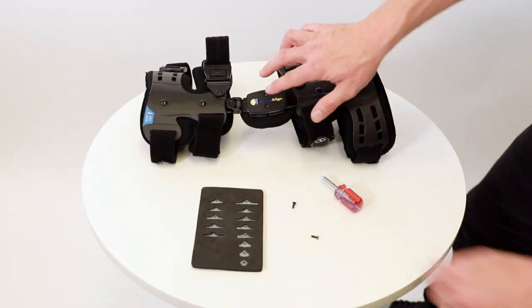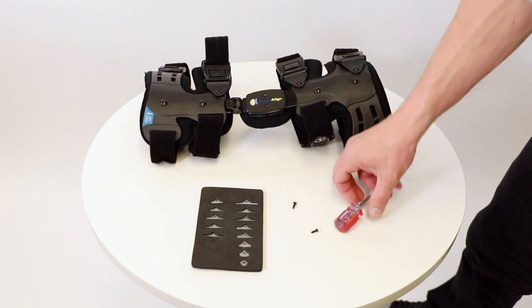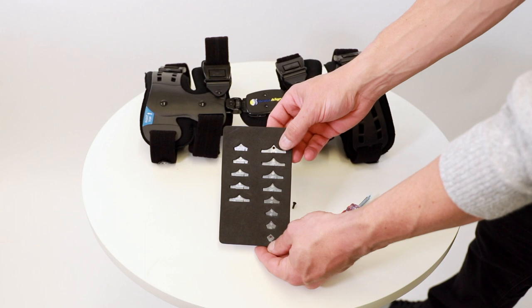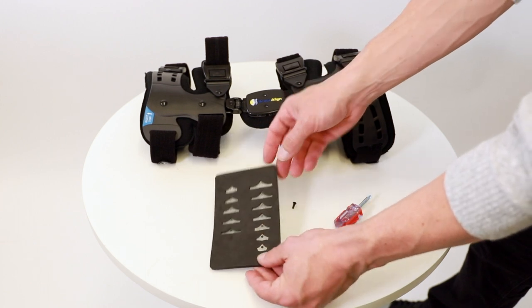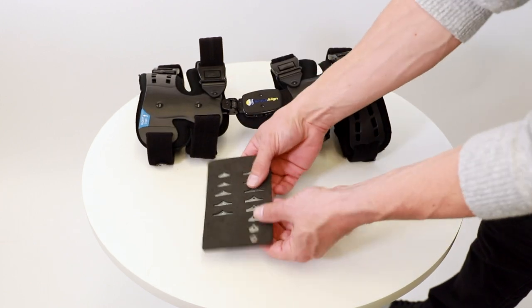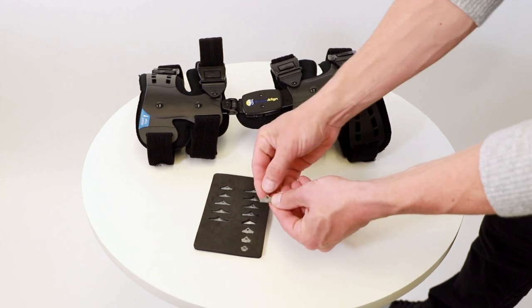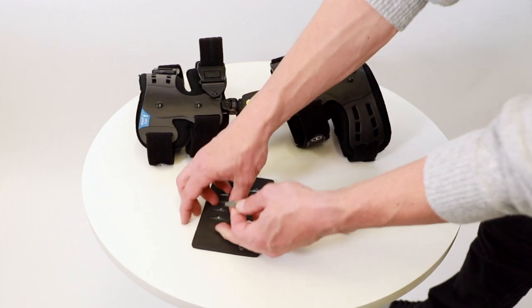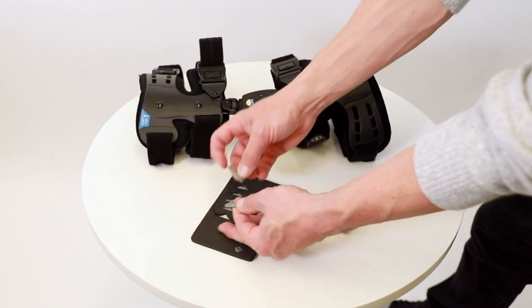Remove both screws on the hinge with the included Phillips head screwdriver. Choose your flexion or extension stop based on your physician's recommendations. Flexion stops have a rounded ridge on the base of the stop, while extension stops have a rectangular ridge on the base.